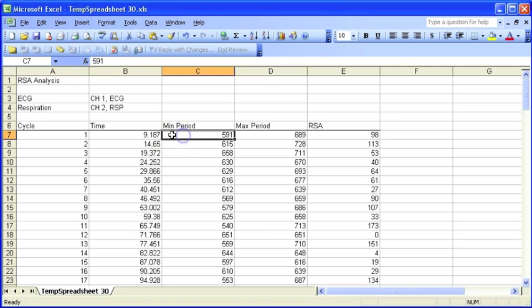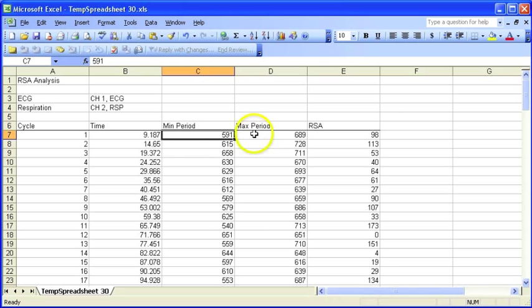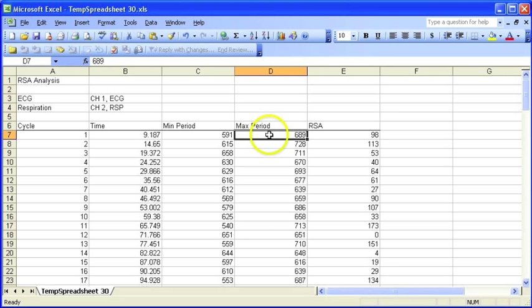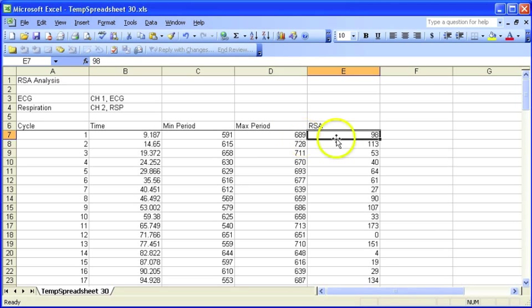This was the minimum R2R interval during the inspiration part. And this is the maximum R2R interval during the expiration. And then the RSA is the difference between the two.